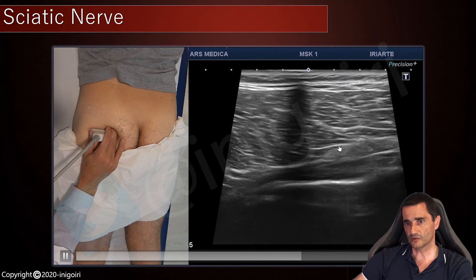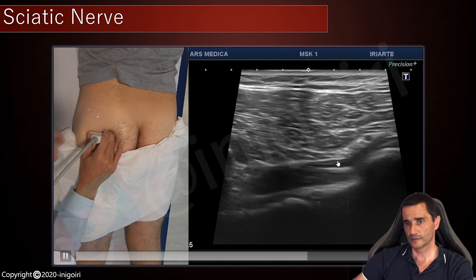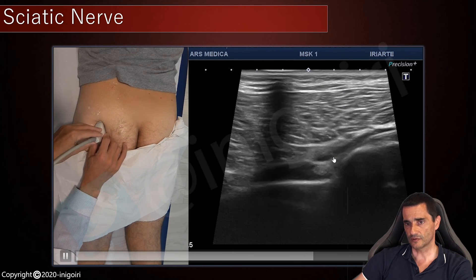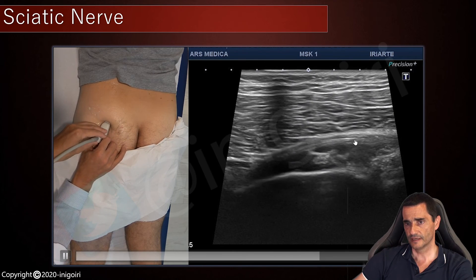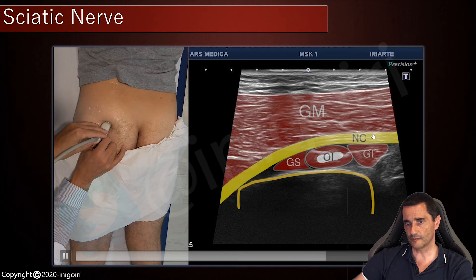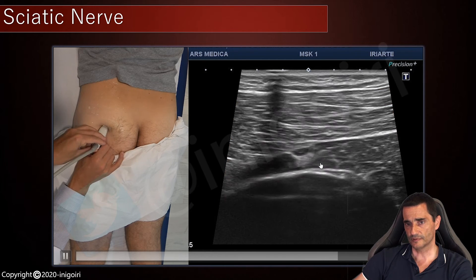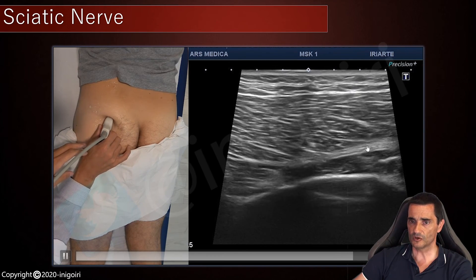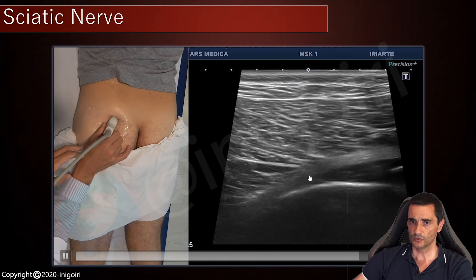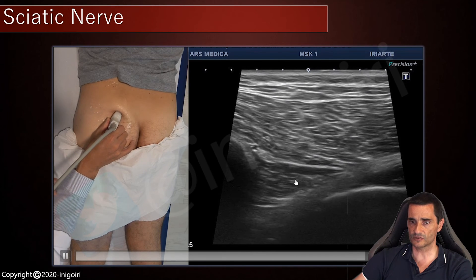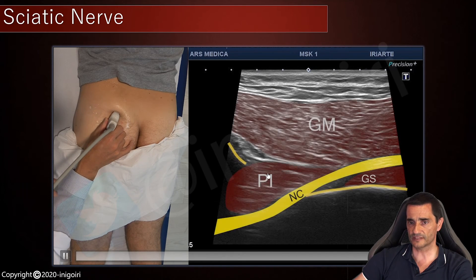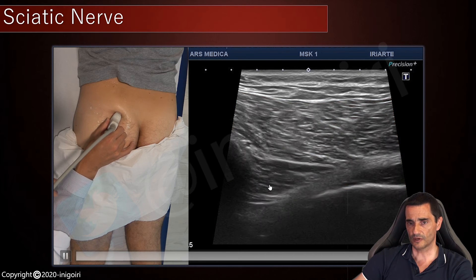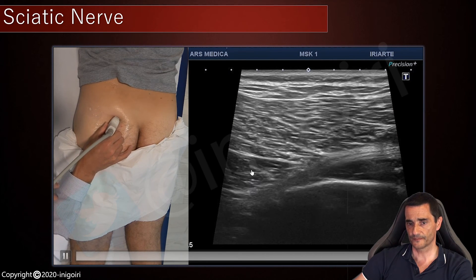We can now turn the probe over the sciatic nerve on its long axis. Here you can see its fascicular pattern and the rotators of the hip. This is the obturator internus and superior gemelus, and how the nerve becomes deep to this muscle. This is cranial, so this will be the piriformis muscle, and how it becomes intrapelvic cranial to the piriformis.